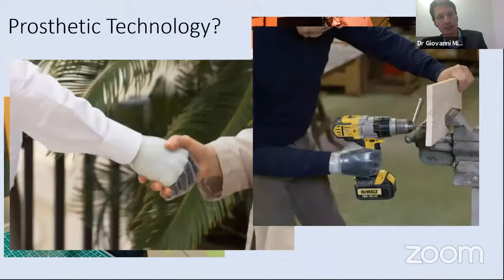In contrast, there are some robotic technologies which are more appropriate. This is a project that I worked on previously, which is, let's say, a hybrid type of approach, but it's still robotics. It's still expensive. And so I learned from that experience in Italy that their view of a low-cost device was 10,000 euros, which obviously to us in a more global setting is just unaffordable. So even for them, low cost was not low cost enough.